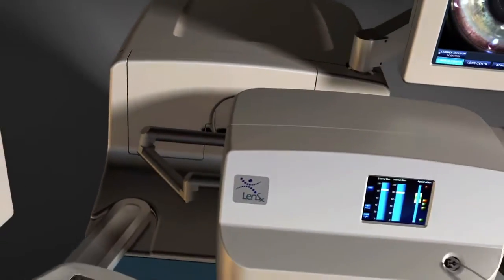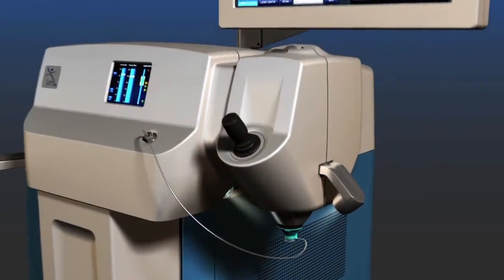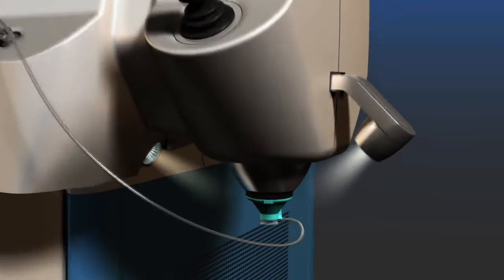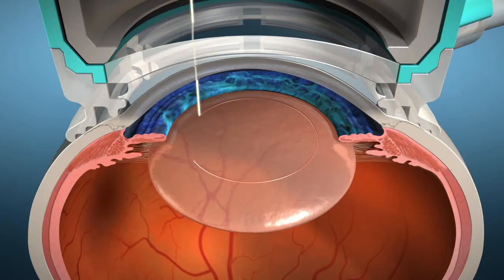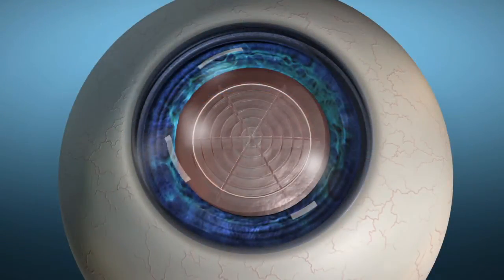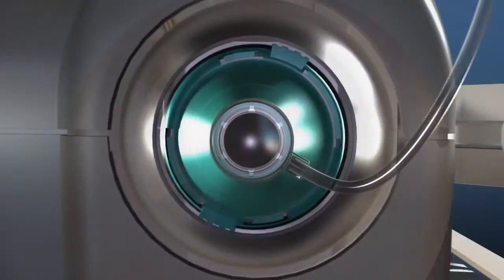The LensX laser is designed to bring advanced levels of accuracy and reproducibility to cataract surgery. By automating some of the most challenging steps of cataract surgery, the LensX laser allows the surgeon to create precise, repeatable incisions using an image-guided laser.